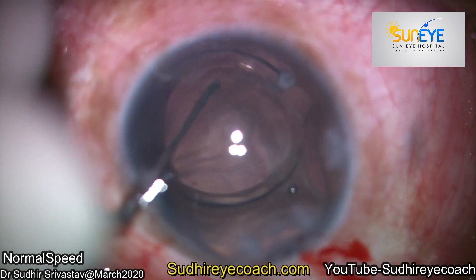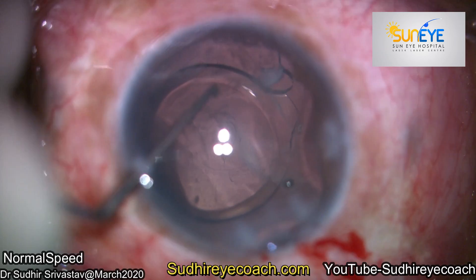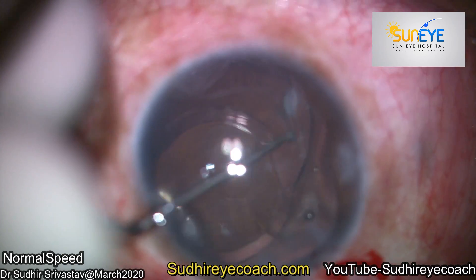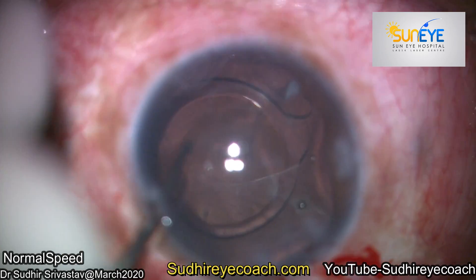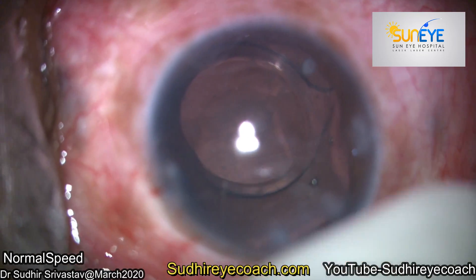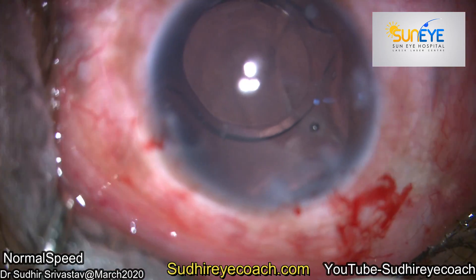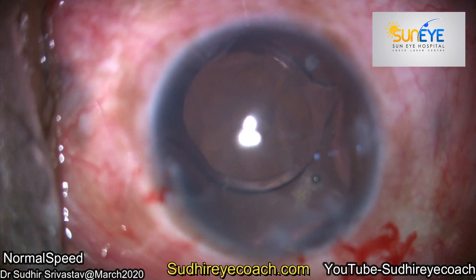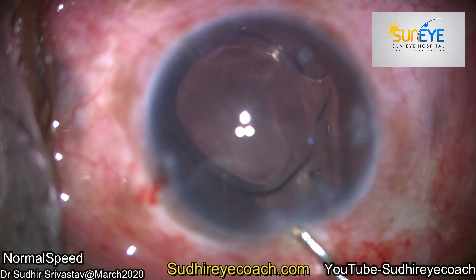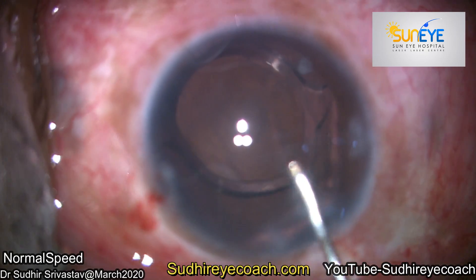The capsule ruptured in an uncontrolled manner because the fluid present in the vitreous cavity came out and extended the posterior capsule opening. Luckily I managed this case, with a slight compromise in the centration of the IOL.